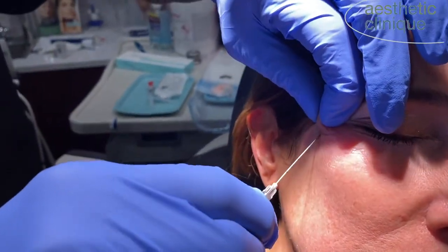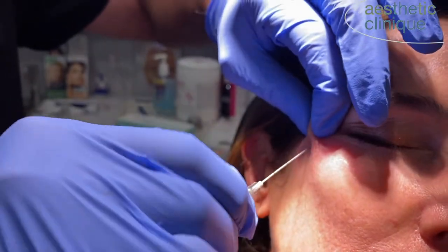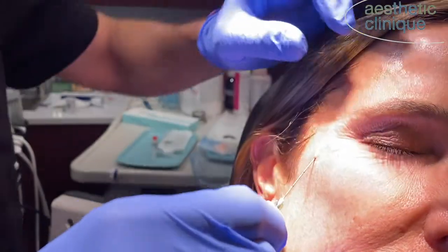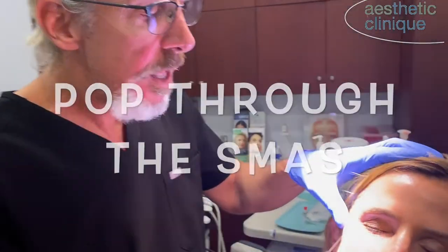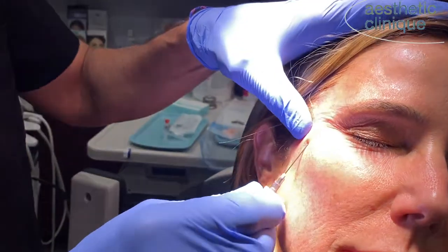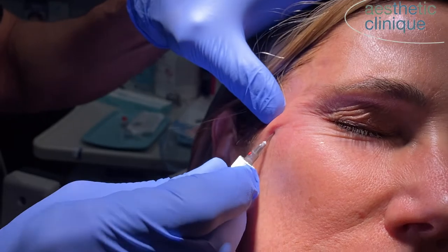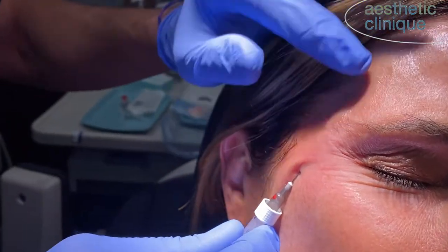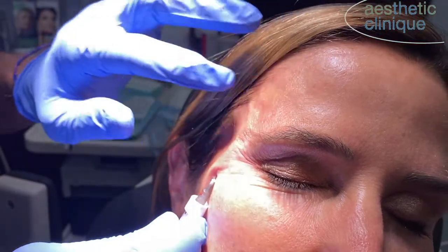Now I'm going to pierce the SMAS. It's a tough layer, but once you're through — see, now I've popped into the SMAS. That should be a glide plane and it should go very easily into that plane. You can see right now the cannula is right here, and I take it all the way up to the temporal fusion line.